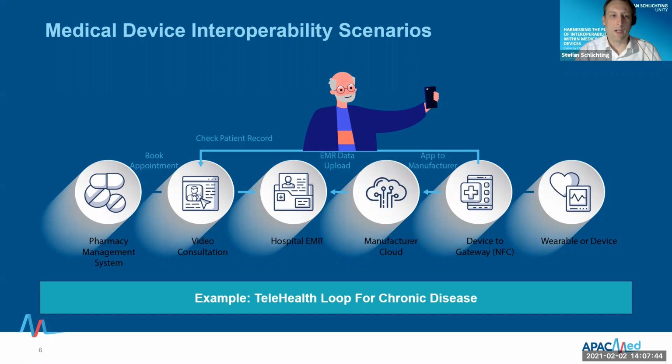And these scenarios really range from a broad perspective, from remote monitoring of daily activities for cancer diagnosis, over to intra-hospital protection of clinical staff while they are caring for infectious patients. But we also have scenarios regarding childhood immunization, or fast infection screening and on-site confirmation for tests at the airport regarding, for example, Corona. For today's presentation, we picked one scenario, the telehealth loop for chronic disease, and I would like to get a little more into the detail of that scenario.